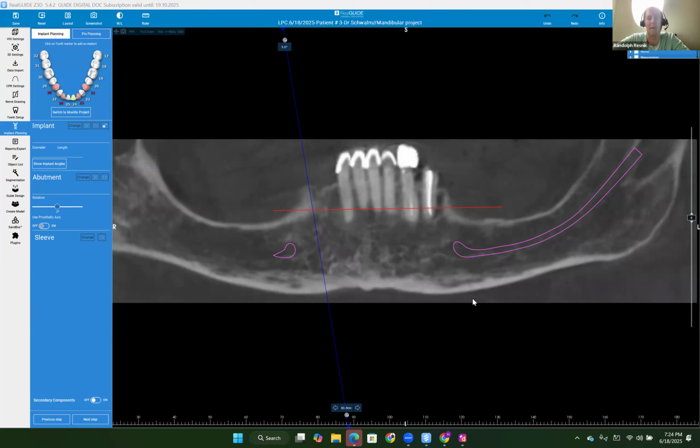So it's good how you outline it and let her make the decision. And what you'll find is your goal is to have 3 implants here, which would work great, because we can position them in a way where if that patient comes back in 2 years, let's say they hit the lottery and they want a fixed prosthesis, we can still use those 3 implants and just add additional implants and convert her to a fixed prosthesis, or if she wants something more retentive there.